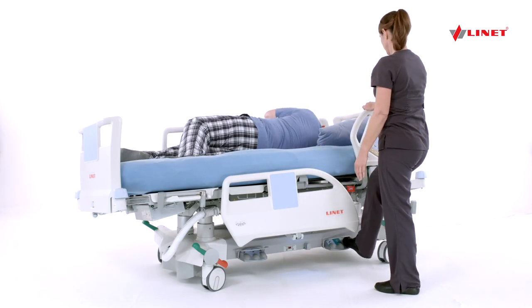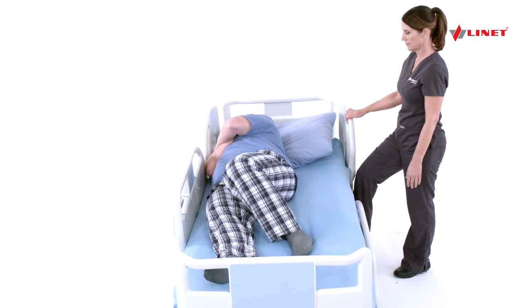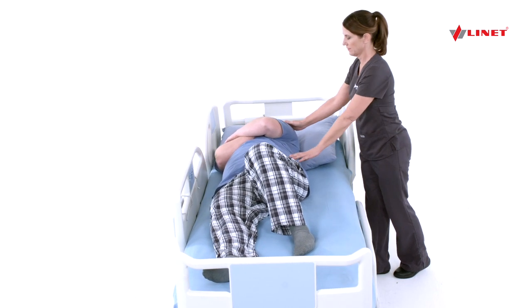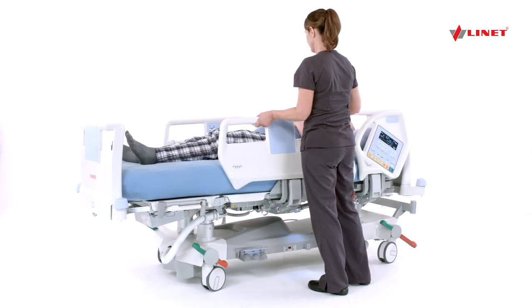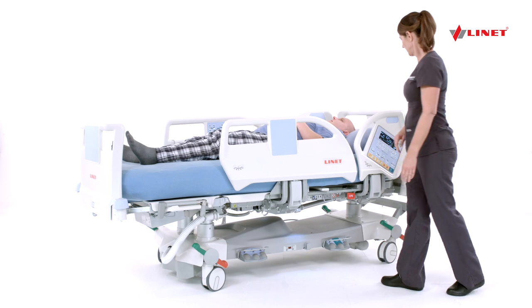Turn the patient back to flat using the right foot pedal. Lateral Tilt buttons are also located on the iBoard panel for caregiver convenience.